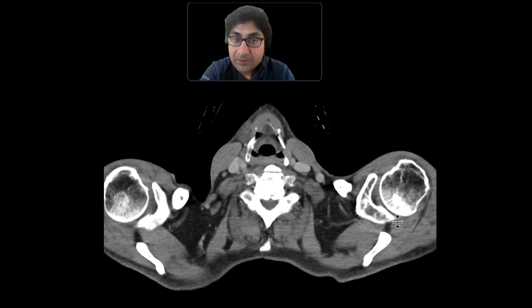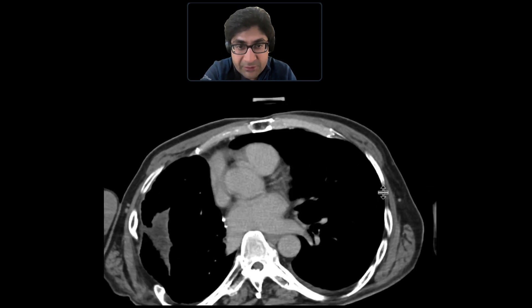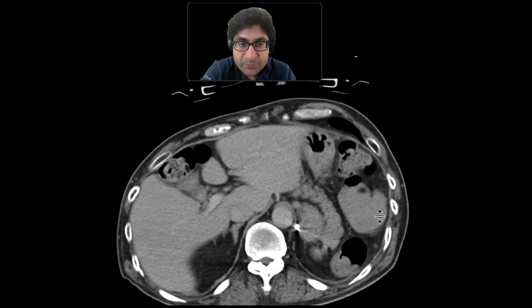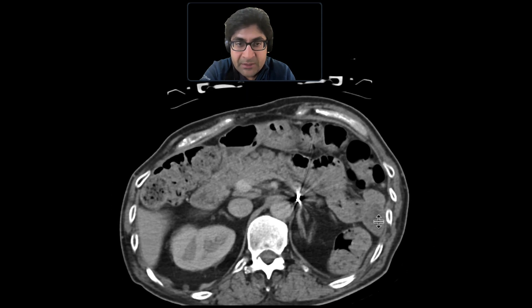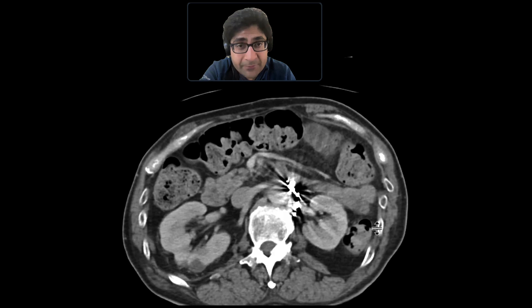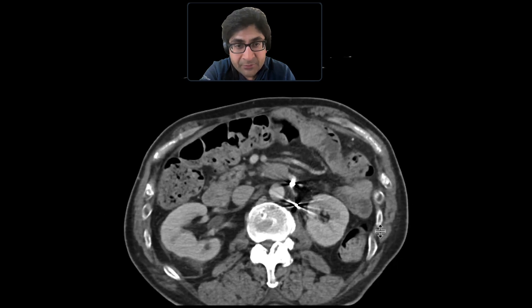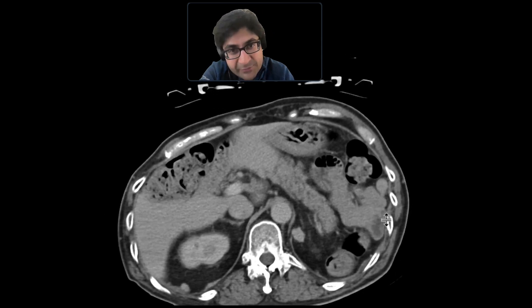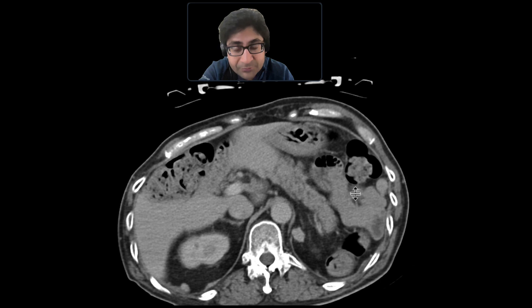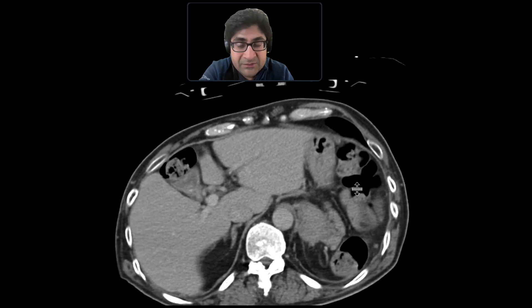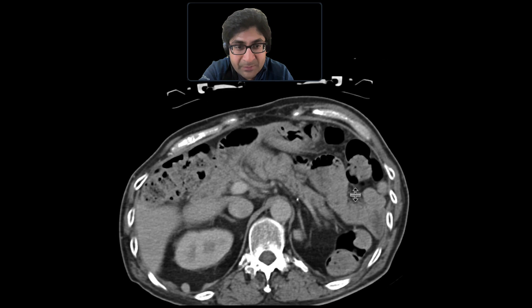This is a patient with a history of lung cancer who comes in for restaging, and we're going to go down to the abdomen and pelvis. As you scroll down, there are a couple of abnormalities that we notice, and I specifically want to guide you to the peritoneal cavity and some of the retroperitoneal spaces.